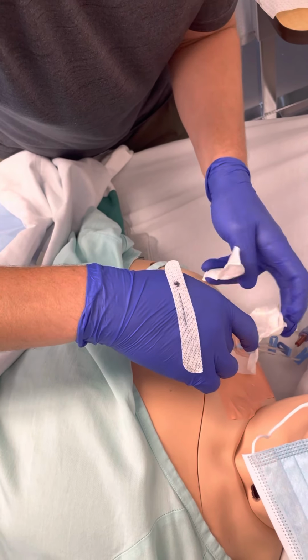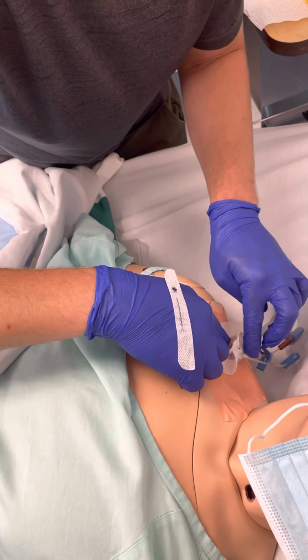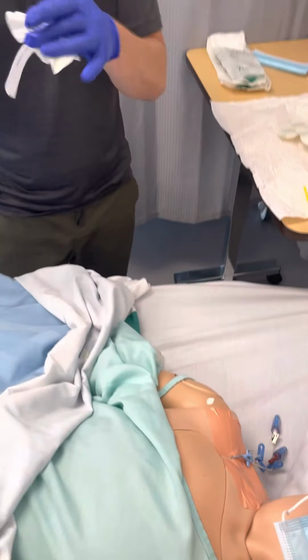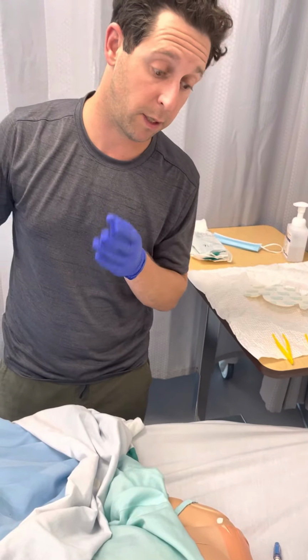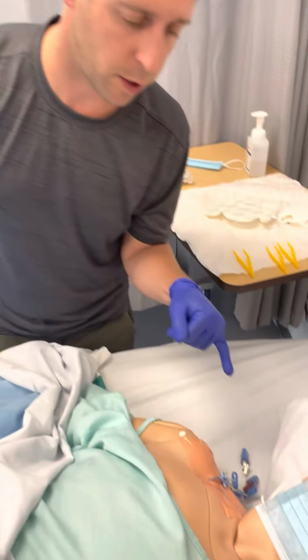And now I should be able to use that to secure. Okay. This can go into the garbage. So that's okay. I did measure. If I didn't measure before, I would have measured before. I would go from the insertion to the end of the hub.